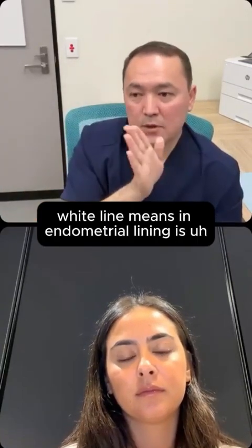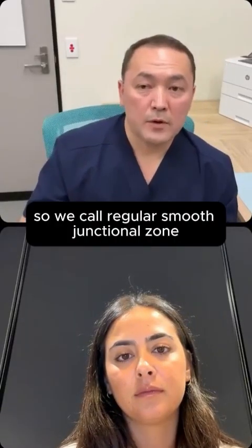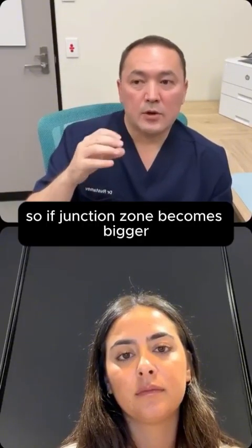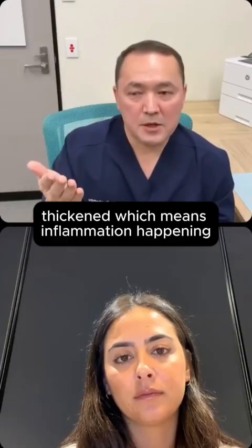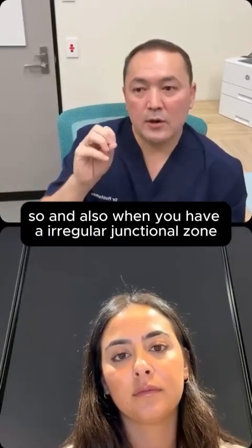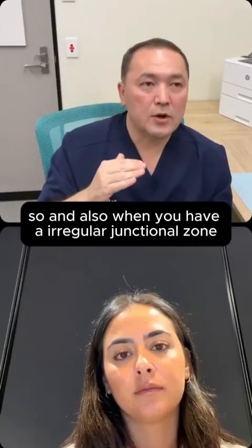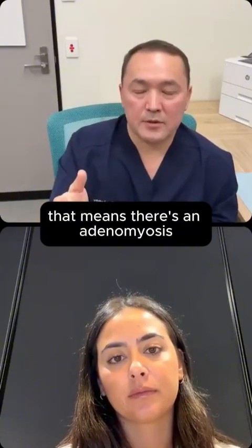A white line means the endometrial lining is going into the junctional zone. So we call it a regular, smooth junctional zone. If the junctional zone becomes bigger, thickened, it means inflammation is happening. Wherever you have inflammation, you have a collection of fluid, and that causes thickening, enlargement of that area. Also, when you have an irregular junctional zone, an interrupted junctional zone, that means there's adenomyosis.